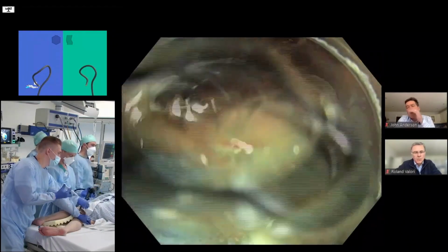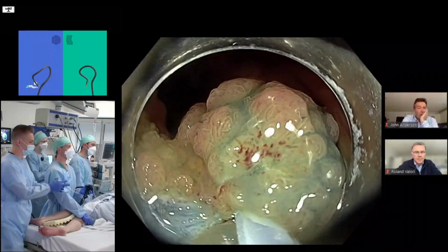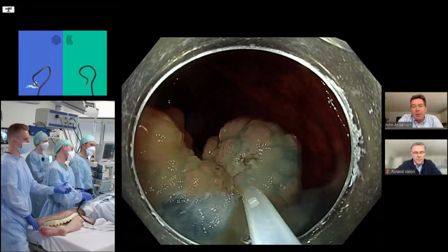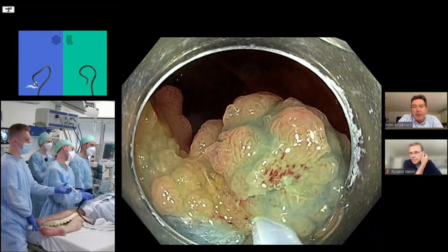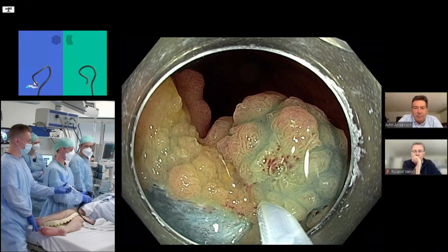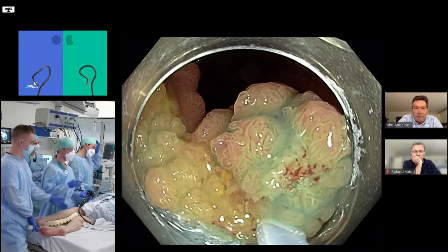Okay, he's got a big piece, John. Yeah, I think it's good, David. You'll test for mobility, but the technique is such that this is safe to take this off. Yeah. Okay, take the snare, go to 1 centimeter.